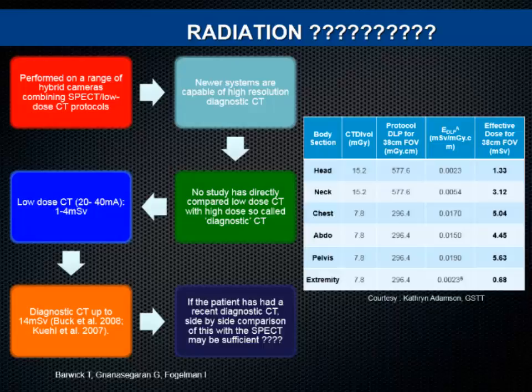But if you want to just localize, for example, in sentinel nodes and other areas, your main thing is mainly localization, not diagnosis. All you're going to say is it is close to that particular muscle or particular organ, then you can do a low dose one. But again, the definition is not clear. People say diagnostic, low dose, high dose. It doesn't mean anything, I think. It depends on individual perception.